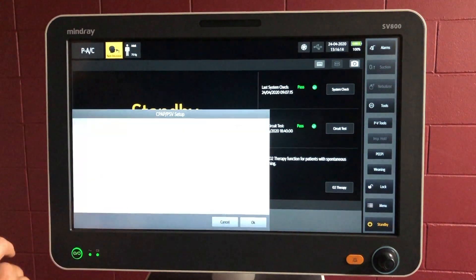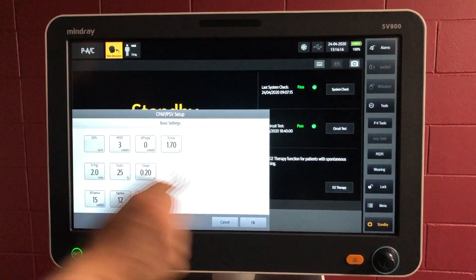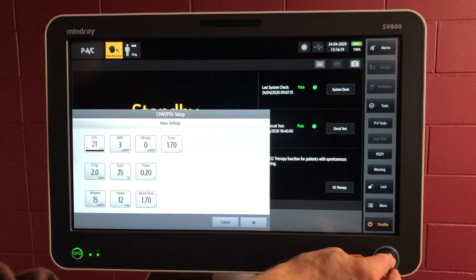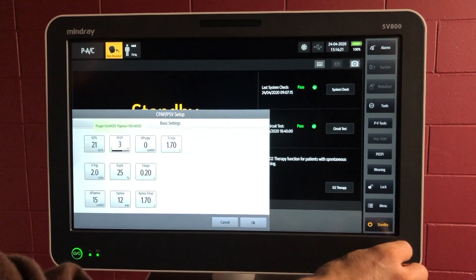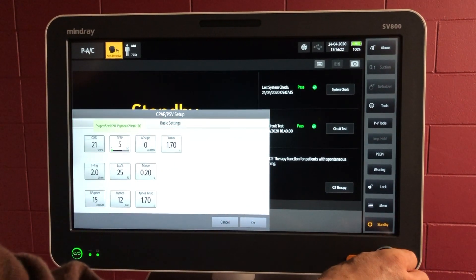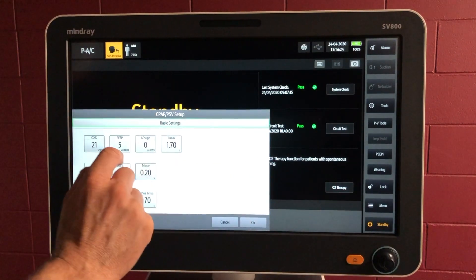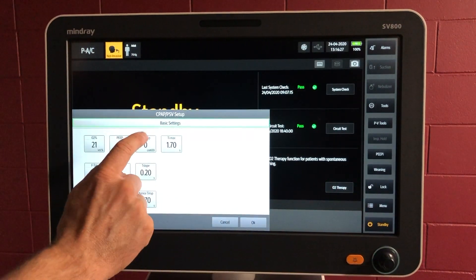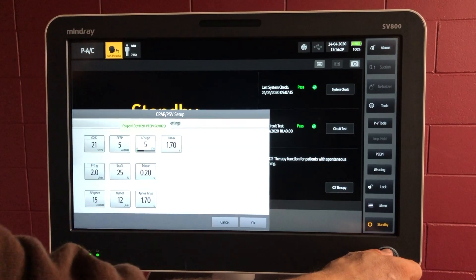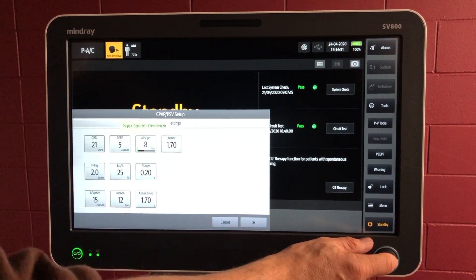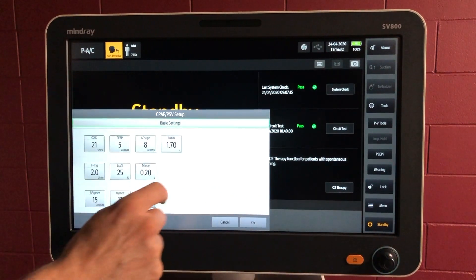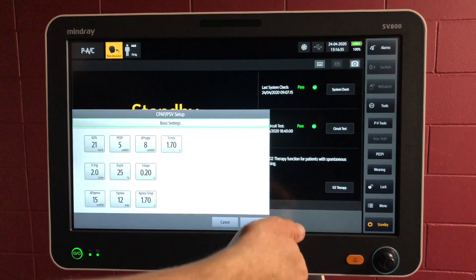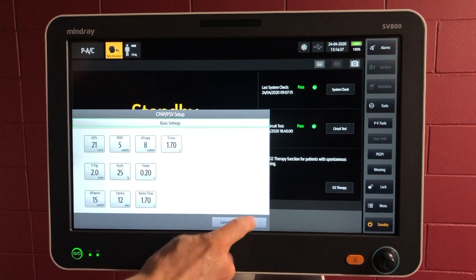Let's go to CPAP with pressure support, and 21% room air. So you select the parameter — let's go with PEEP of 5. Select, adjust, and then confirm. Pressure support of 8. All the other settings here can be selected, adjusted, and confirmed.